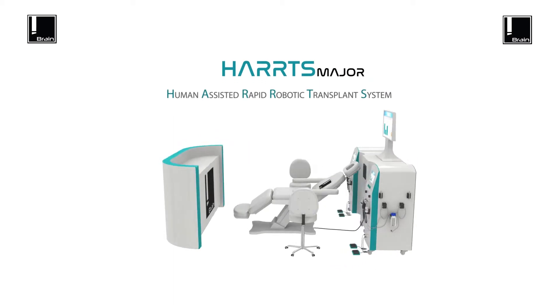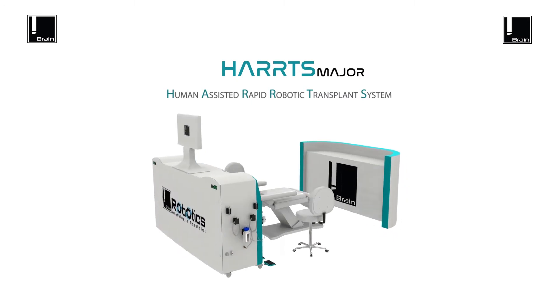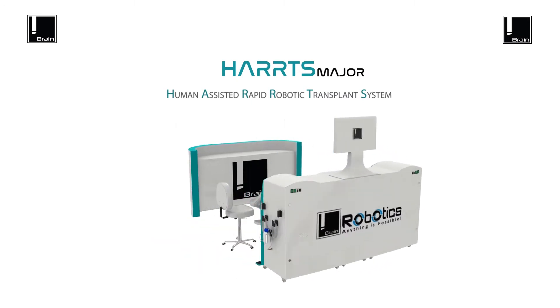Introducing HARPS — Human Assisted Rapid Robotic Transplant System. Revolutionizing the way FUE hair transplants are done worldwide. Win your patients' hearts with the robotic touch.